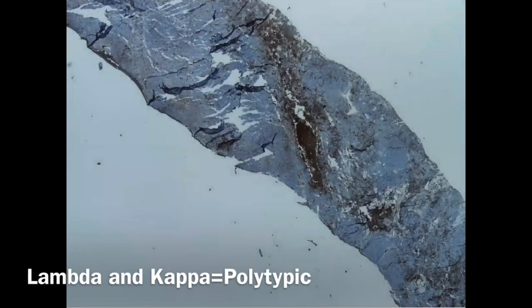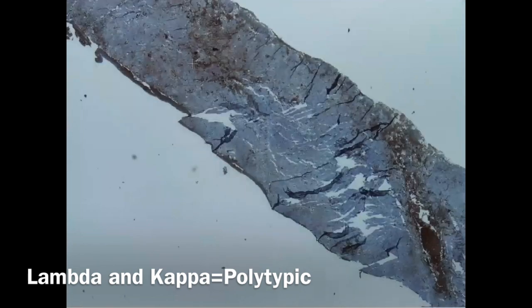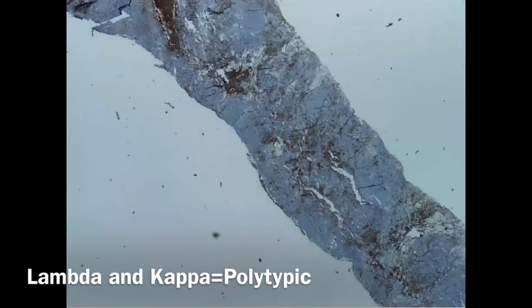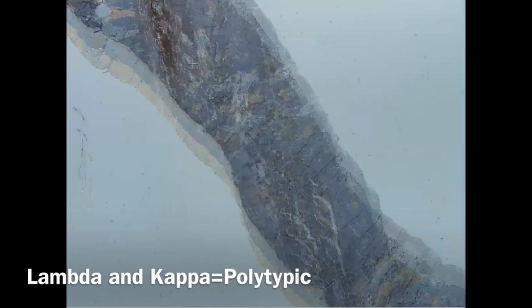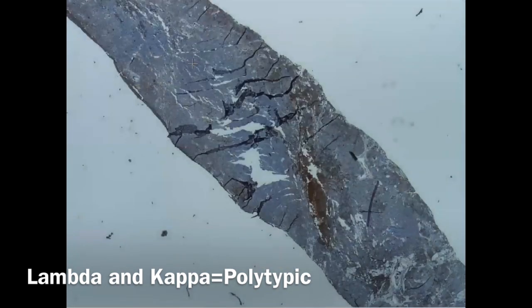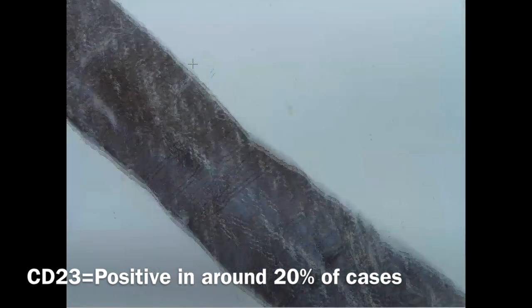Let's see if we have any restrictions, whether lambda or kappa. And this is the lambda stain. Please remember this figure. I will put the kappa one to compare. This is the kappa stain, and I think they all look the same. So this is polytypic, or it's non-contributory in this case. I will go extra for CD23. It can be positive in about 20% of cases of marginal zone lymphoma, and here it is positive.